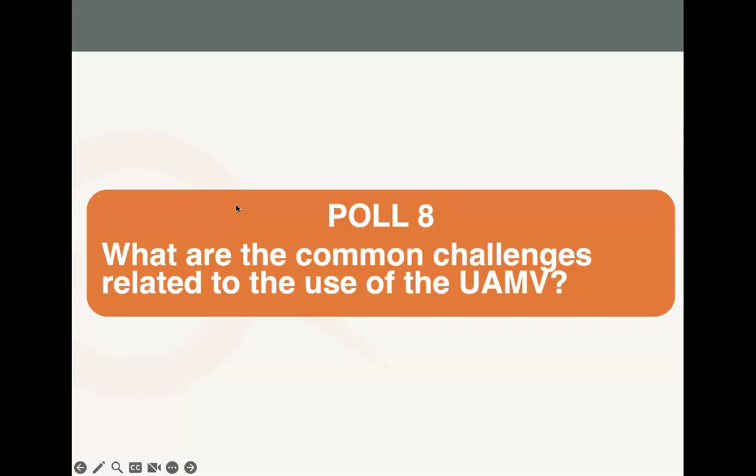So just to emphasize that flow sensor calibration and making sure that the flow sensor is always healthy and functioning well is as key as making sure that the whole ventilator is working well. So let's make sure that we always pay attention to the flow sensor. We calibrate usually, like Dr. Sweetbit mentioned, every 2 to 3 weeks during your machine check, and just make sure that you have the correct measured parameters on the monitor.